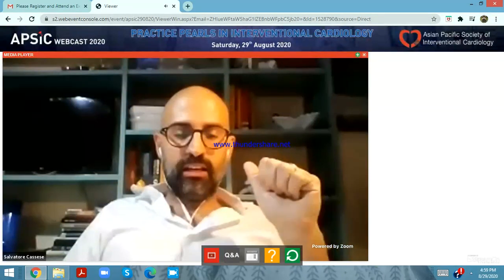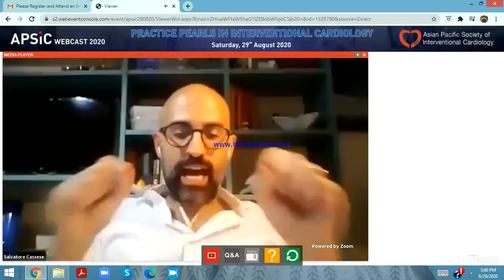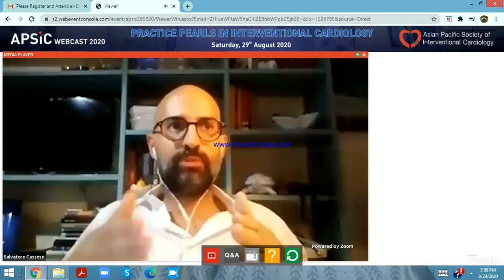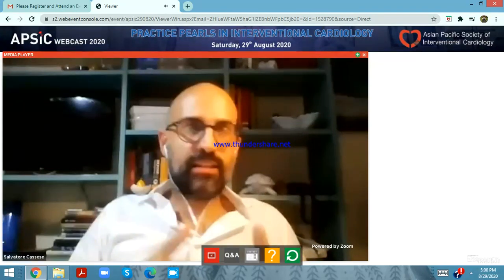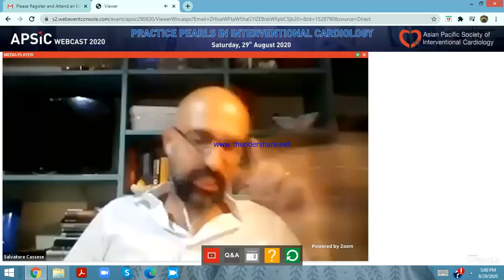Very fast answer. It could be an option, but you can see the extension of the calcium. You know that lithotripsy comes in a 12 millimeter size, but I would like to leave that technology to the next presentation, which is on that subject. And regarding crossability, every device that you use for calcified lesions, you have to pay something in crossability because you have another objective. The crossing profile of the lithotripsy balloon is not so user-friendly, and the ultra-high pressure balloon also has a slightly bigger crossing profile than the normal non-compliant balloon. For this reason, very often we use the combination of rotablation and super high pressure balloon instead of lithotripsy.